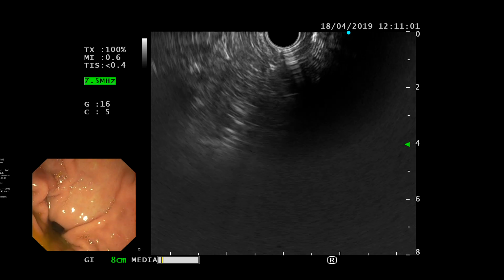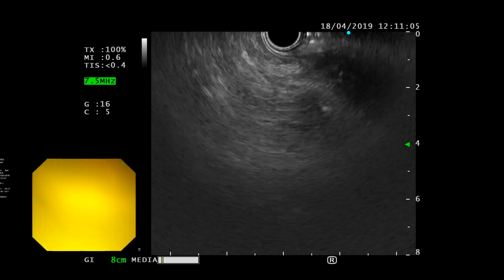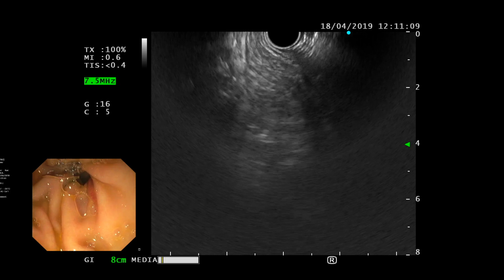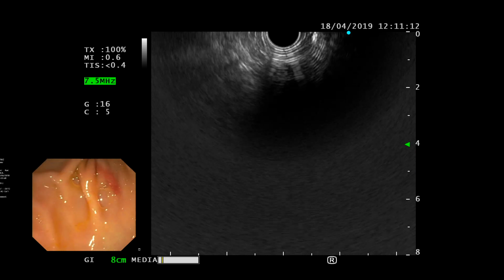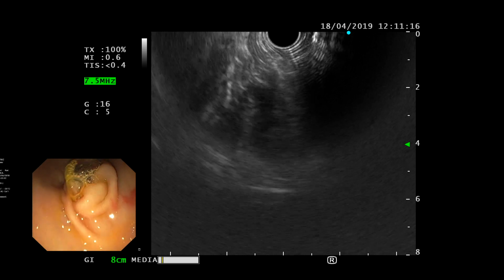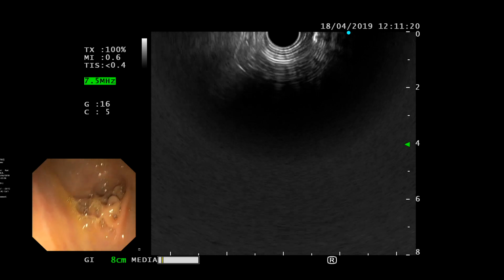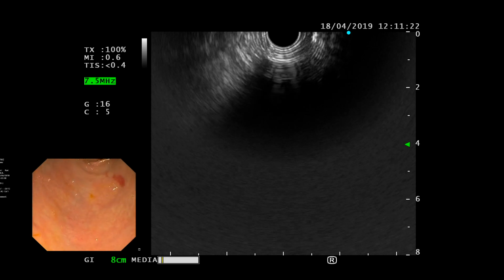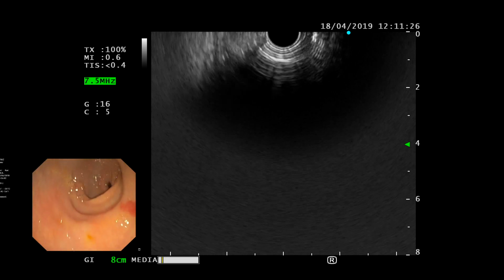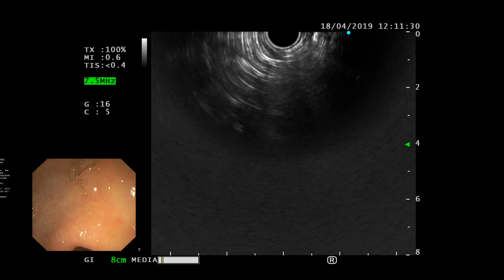You want me to continue? Yeah. Because it's like ERCP, right? So just big wheel towards you. So remember this is side view, right? So you have to big wheel towards you. It's like in ERCP, you have to get over it to get inside. So wait, before you do that, stop. Pull back a bit. And big wheel all the way towards you. More. Now advance. There you go. Because otherwise it's like a side view where you're pushing against the gastric wall.